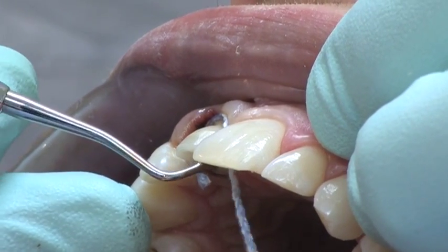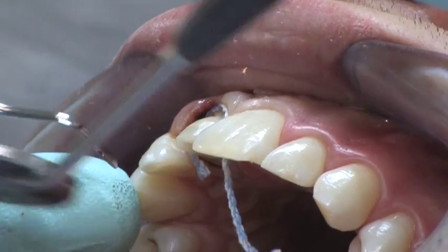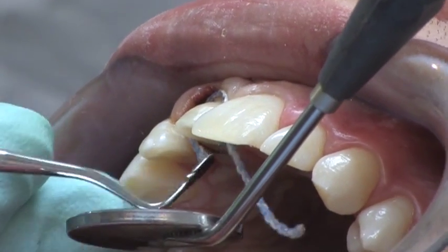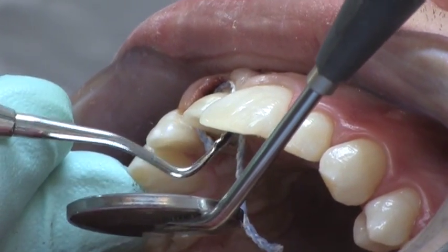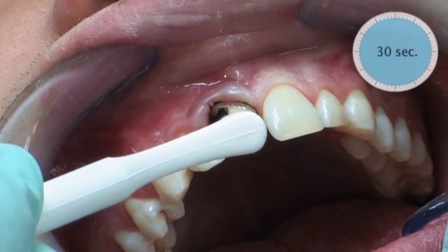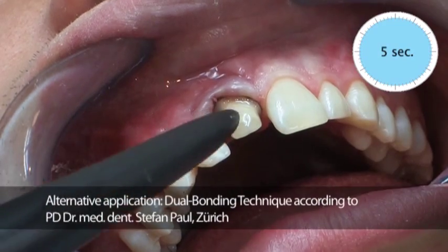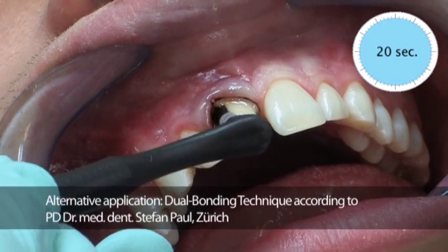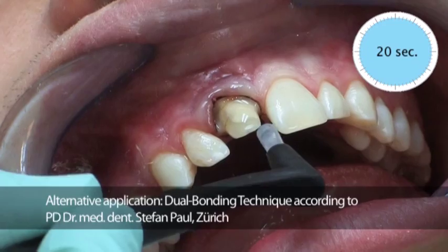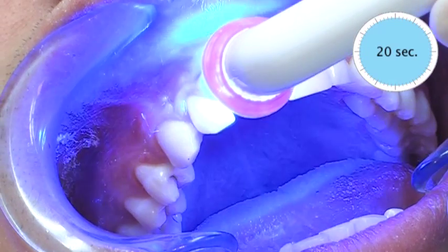Atraumatic compression of the gingival tissue is performed before the final impression is taken using a suitable retraction cord such as ParaCore, with a stable structure and a high absorption capacity. Application of a multi-component bonding system such as ART Bond before the final impression seals the dentin tubuli and increases the retention of the restoration. Dr. Paul describes this as the dual bonding technique. The oxygen inhibition layer must be removed afterwards, leaving no residue.